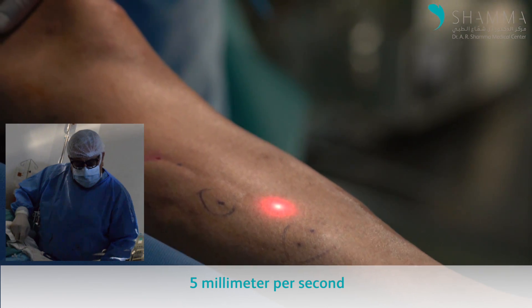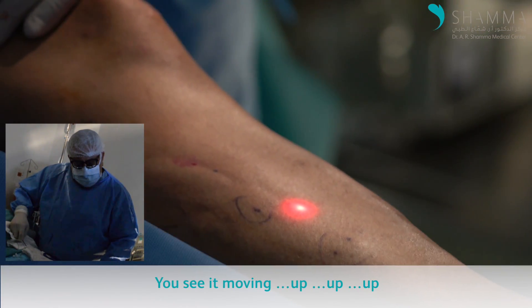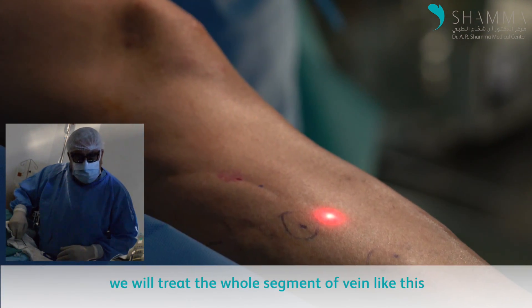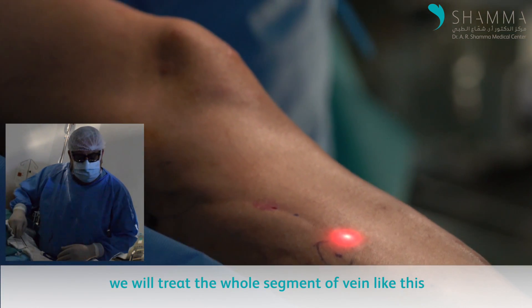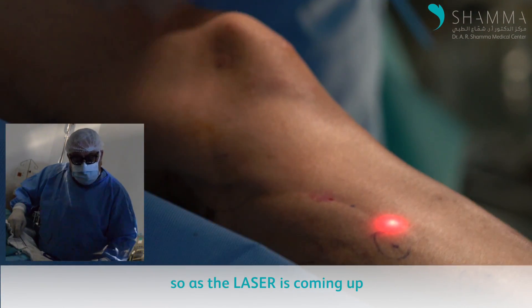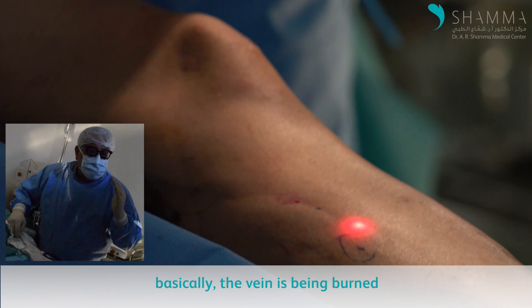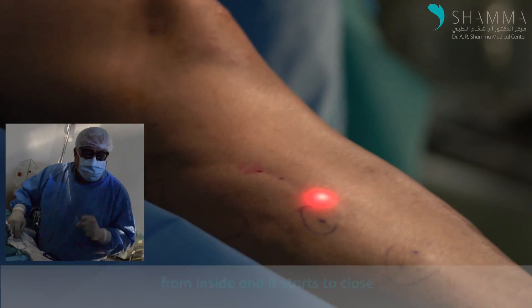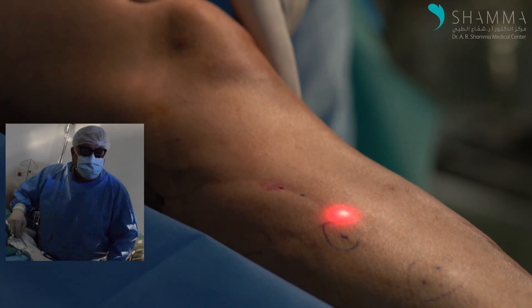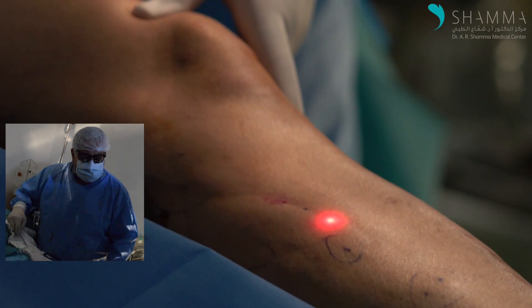You can see it moving up. We treat the whole segment of the vein like this. As the laser comes up, the vein is being burned from the inside and it will be closed. This way we can treat the incompetent saphenous vein without having to remove it, under local anesthesia.